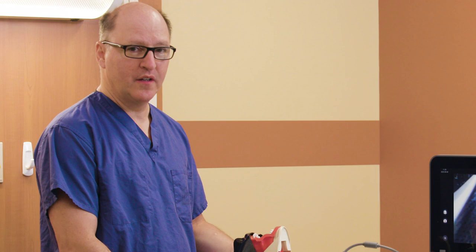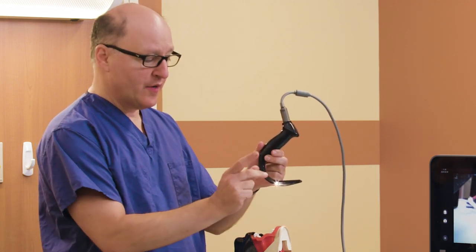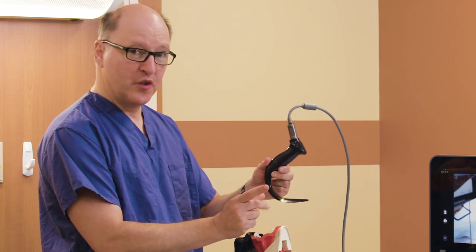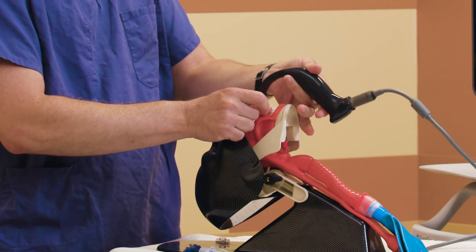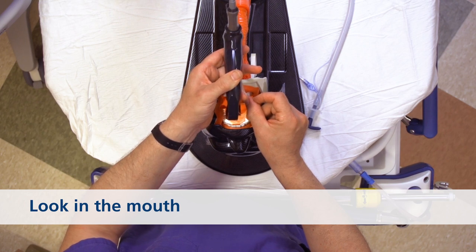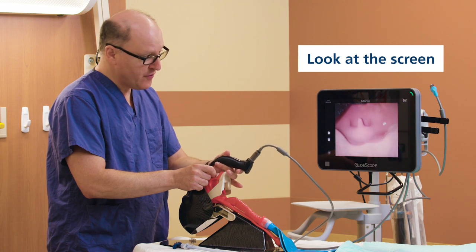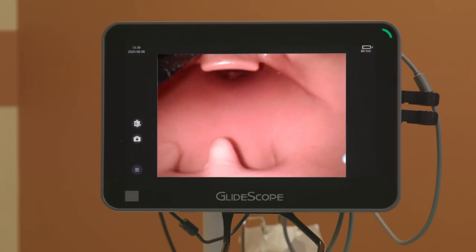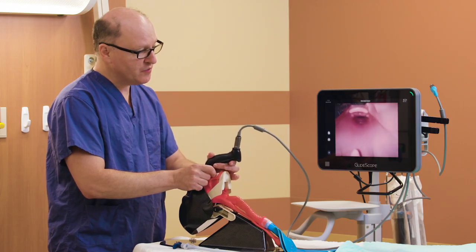Let's run through hyper-angulated video laryngoscopy with the GlideScope. I pick up the instrument with a two-finger grip. I'm going to scissor the mouth open using one and three. Very lightly gripping the blade, I am following around the curvature of the tongue. The first landmark to appreciate under direct vision is the uvula. Now at this point, I can rotate the blade further in until I can see the tip of the blade seating in the vallecular, and here minor adjustments will change mechanically how well the epiglottis is elevated.